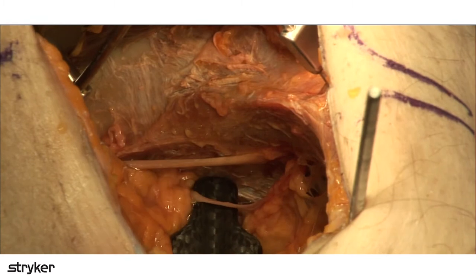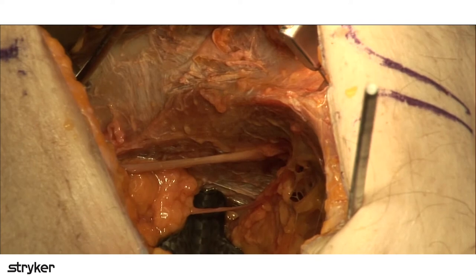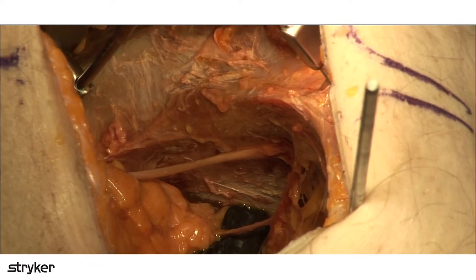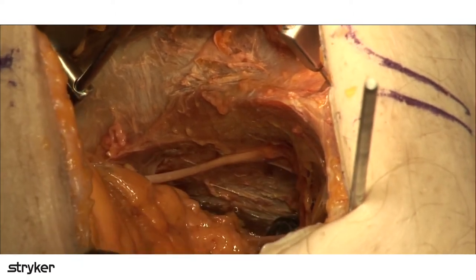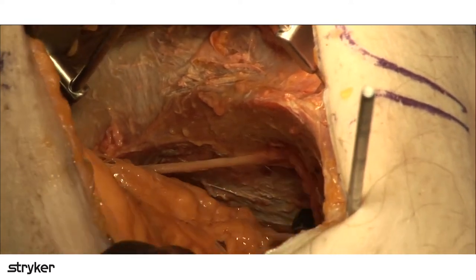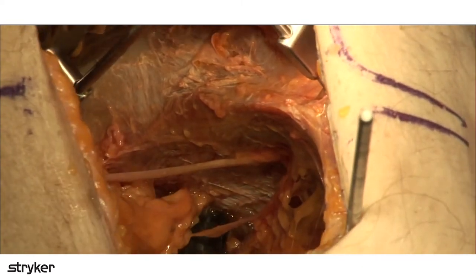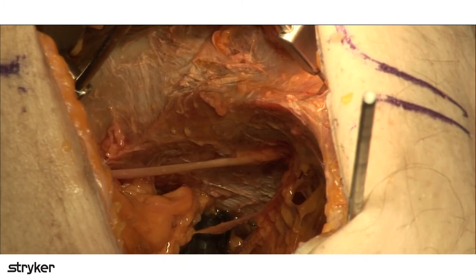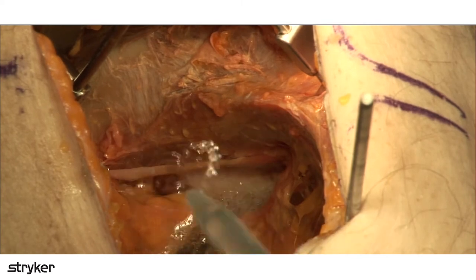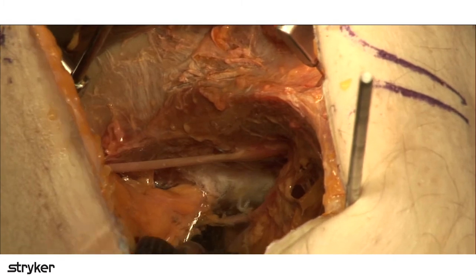But it also has a little suction device at the base of it, which helps to remove the fluids that accumulate at the base of the wound. You can do a number of things with this retractor. You can put it into the greater notch. You can lean it up against the posterior column or the lower part of the quadrilateral surface, or you can even go into the lesser notch with it right there, depending on where you're working and what you want to see. So that's kind of a nice little tool. And here's a demo. Look at all that blood. Listen to all that noise. Very nice. Okay, there you go.